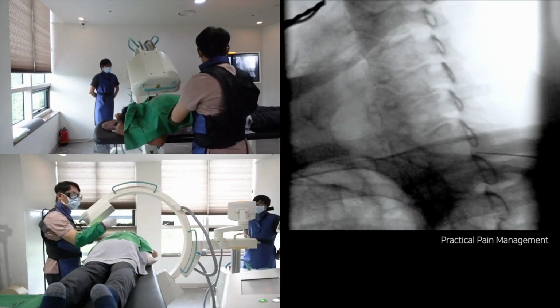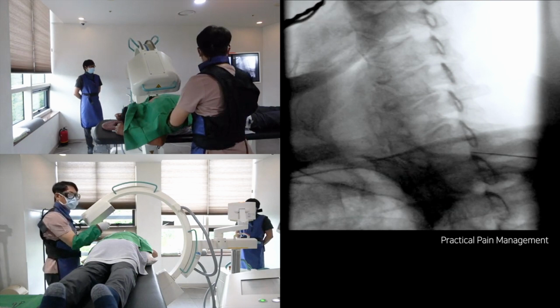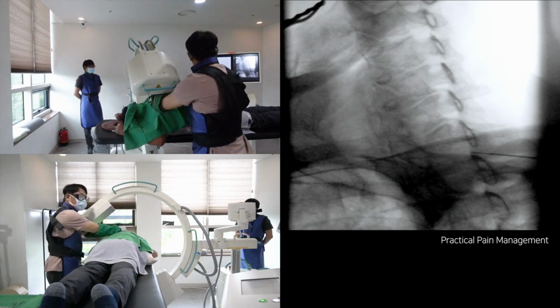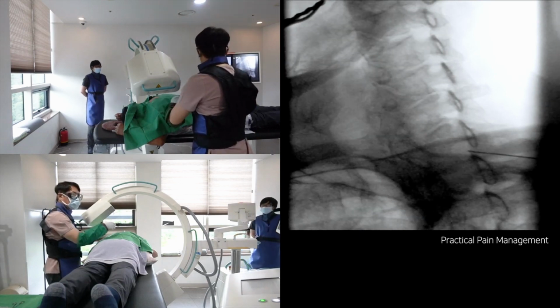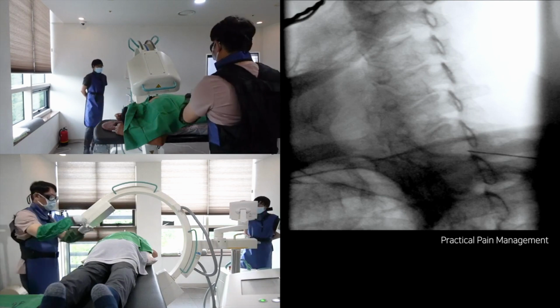Upon rotation, the compass indicates about 60 degrees. As I observe the lateral profile view of multiple cervical laminae, I draw an imaginary line connecting the innermost aspects of the laminae. The needle is directed toward the central aspect of the interlamina space. As the needle nears the posterior dural line, it's crucial to be wary of accidental penetration into the dural space.